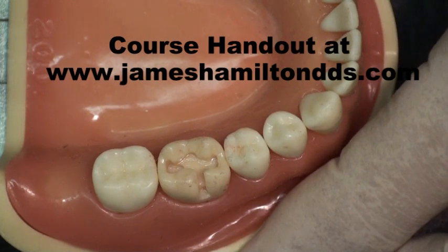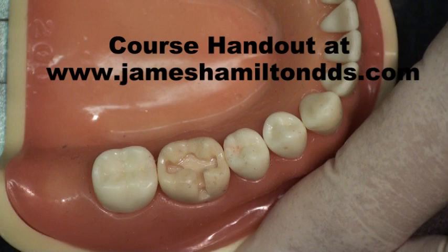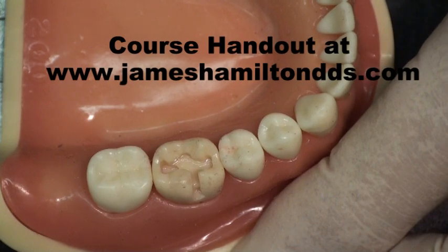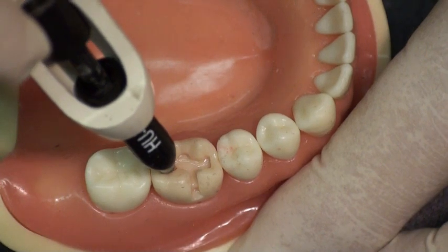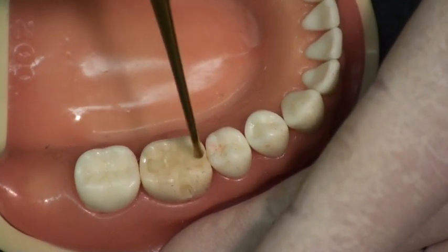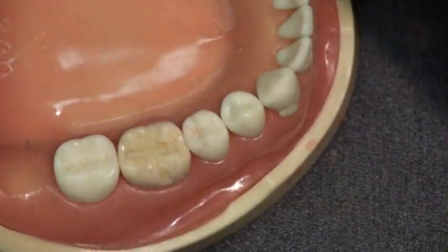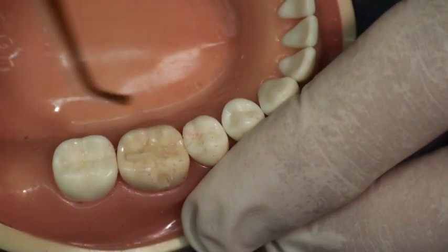We've now prepped the tooth, and during that preparation all the red wax would have easily been removed. In most cases, undermined enamel would be removed and this preparation would be larger than you see here. But that is okay since our custom occlusal matrix covered the entire surface of the tooth, and consequently any composite replacing that surface would have been easily contoured. We're going to fill this up using as many layers of composite as you want. In this demonstration we're only going to place one layer — there are now materials that can be used to fill the tooth all at one time. With the clear custom matrix technique, you don't want to place more composite than you need, so we're removing what we believe to be excess composite.